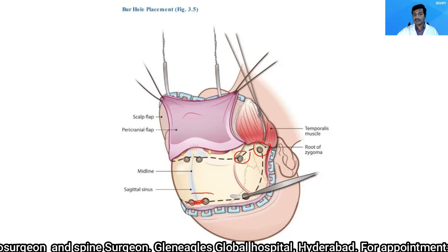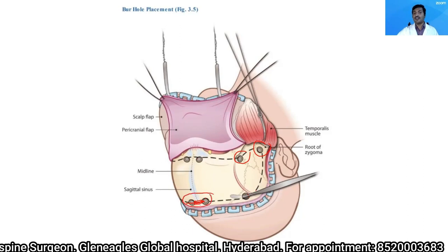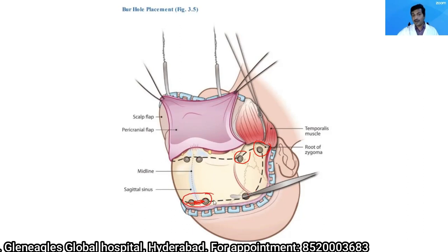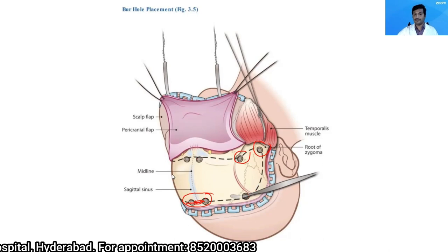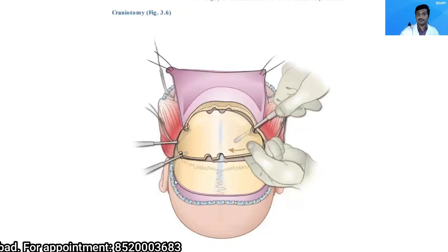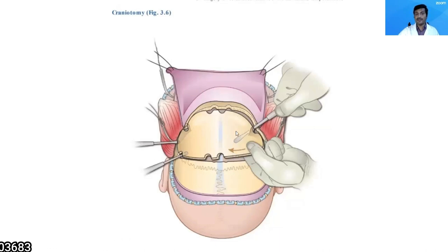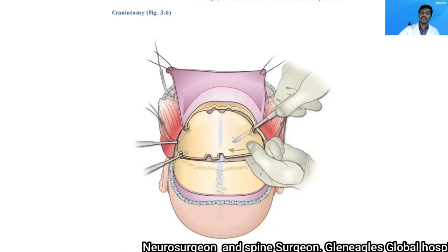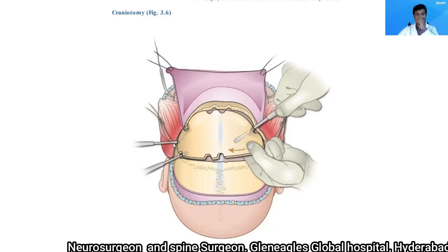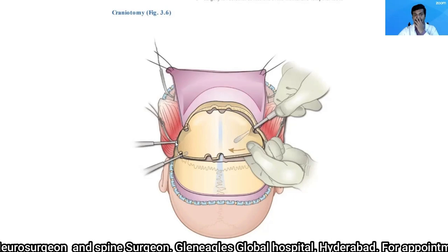This midline connection is performed last — only after connecting all other burr holes with the craniotome. Once the craniotome run is complete and the frontal sinus has been addressed, reflect the bone flap back.